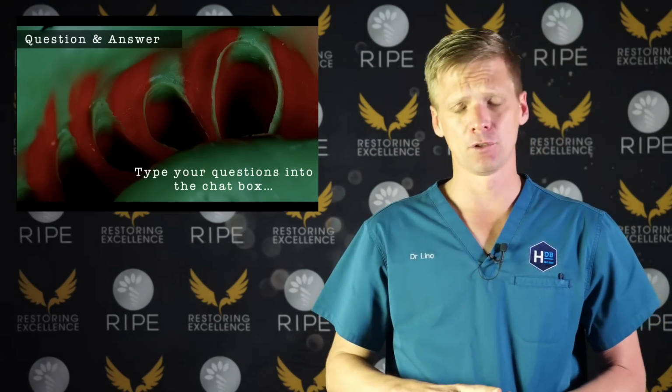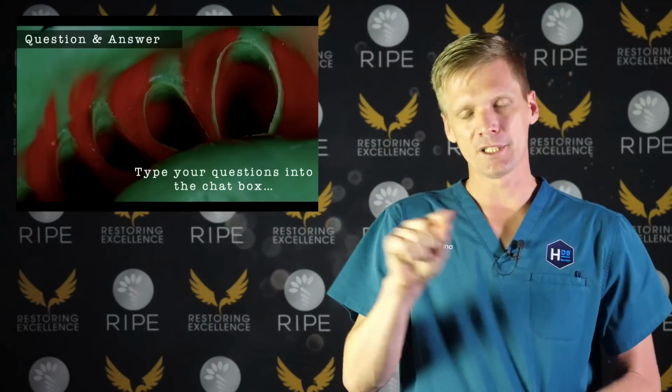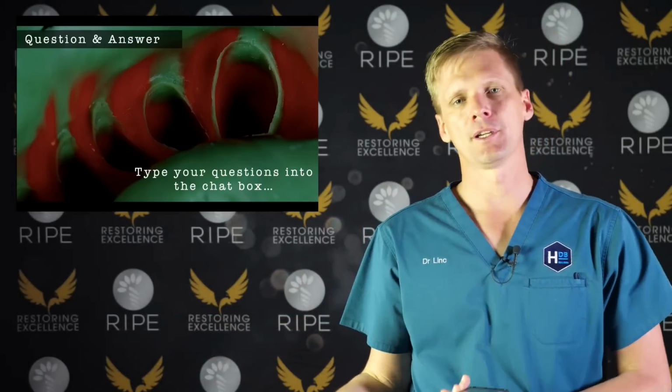Now there's a very important thing to do with veneers. Sometimes when you're doing a veneer that seats from the facial, you actually do have a little black triangle there, which the patient doesn't care about and you don't care about.